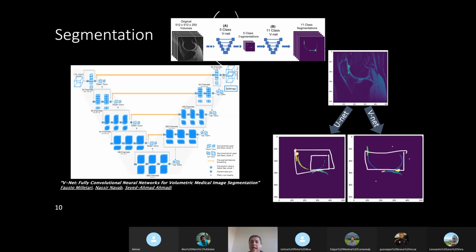So that's why we focus on this kind of segmentation, and we use it since we do have a very good model for the segmentation. The segmentations using this model are of very good quality, actually. We can do better than high 70s and low 80s dice scores. That's what we get on these evaluations. We evaluated on external data sets, and the best we can do is like 80 something dice.